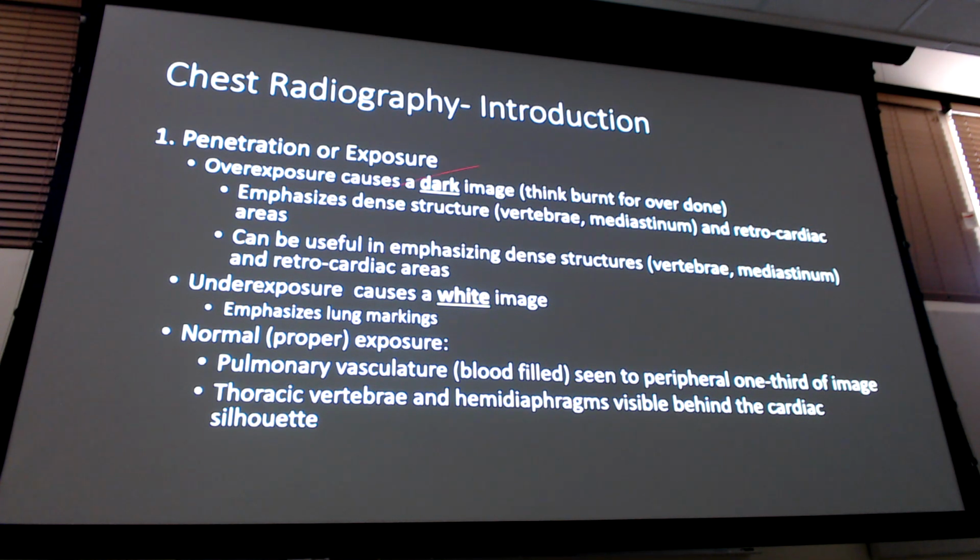So we're going to take a look and see what those look like for the overexposure and the underexposure, and how you can notice and look at it and go, that's not right, right? I need you to get another one, x-ray person. Go do it again, right? Politely, nicely, don't be a jerk, right? Good, because sometimes they're like, that was the third one I did. It's the best we got right now because they're in a bed, they're unconscious. I did the best we could. It's the highest technique we have. It is what it is. Okay, cool. That's not their fault, right? But give them a chance to have that conversation with you.